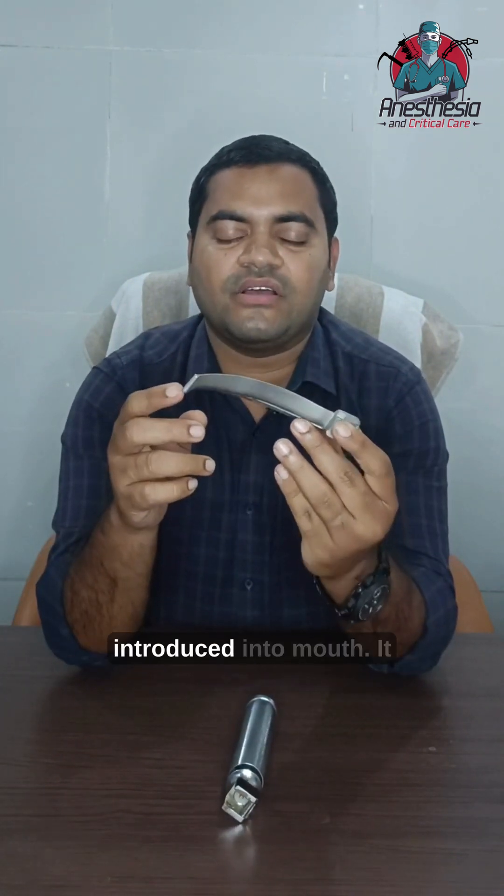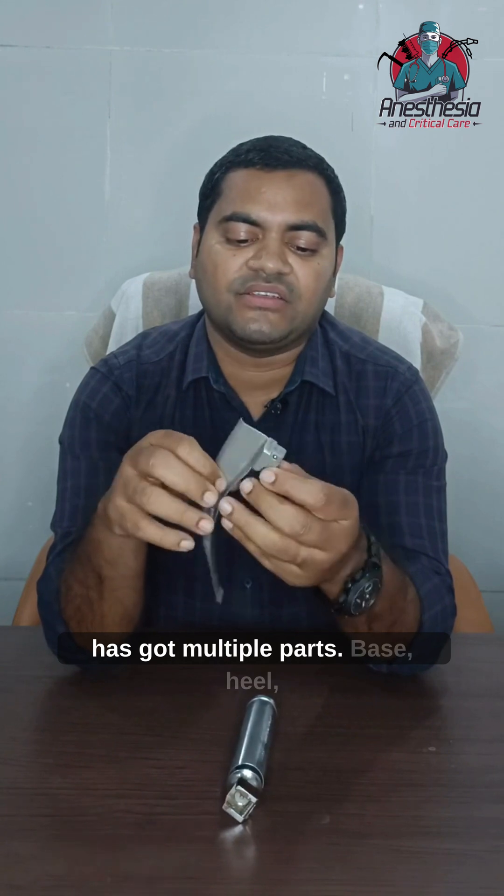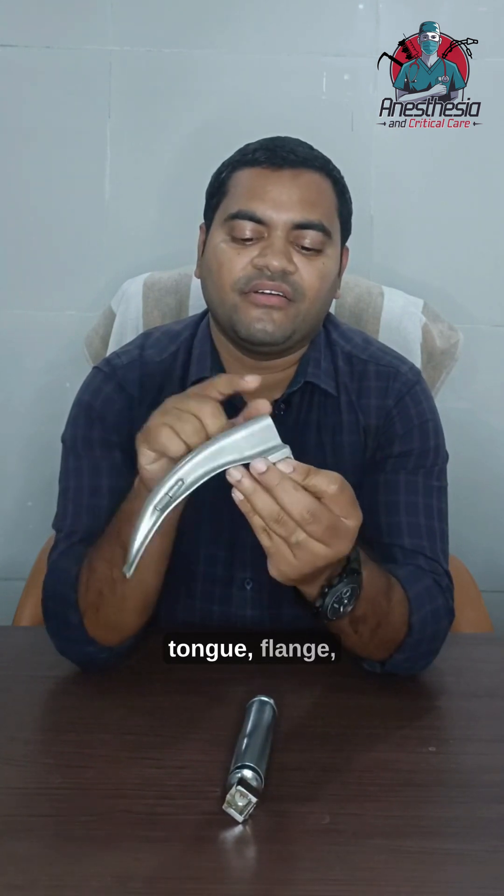The second part is the blade. This part of the laryngoscope is introduced into the mouth. It has got multiple parts: base, heel, tongue, flange, web, and tip.